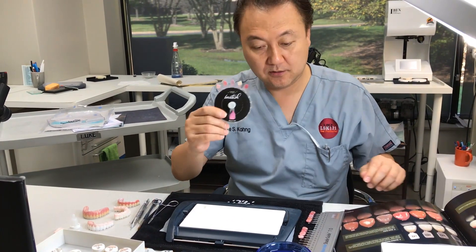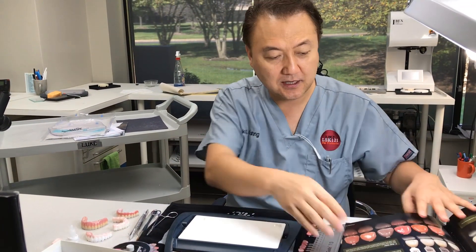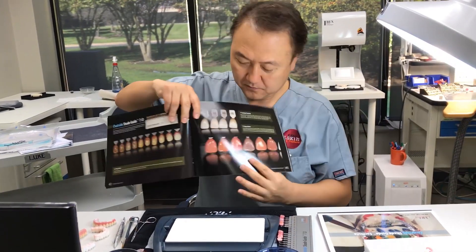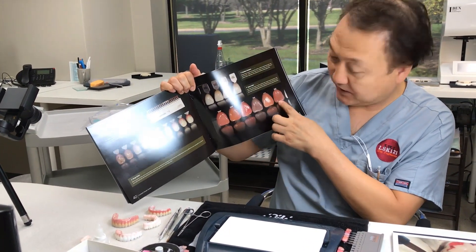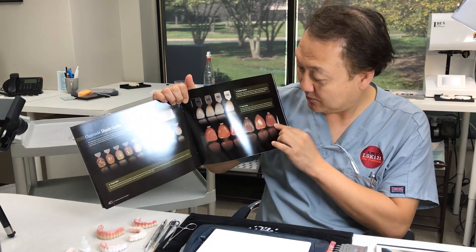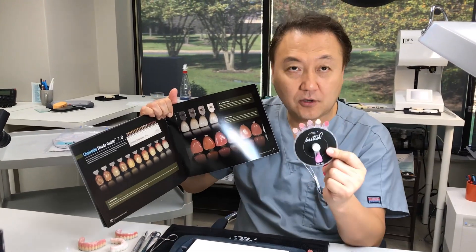I'm going to make a better color than this because natural teeth color has a lot of different color. So I made the color all the way from here. Then I'm going to explain my recipe — how I can achieve this color from regular pink color.